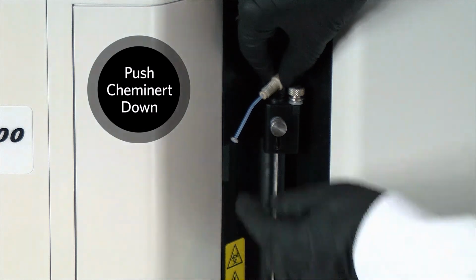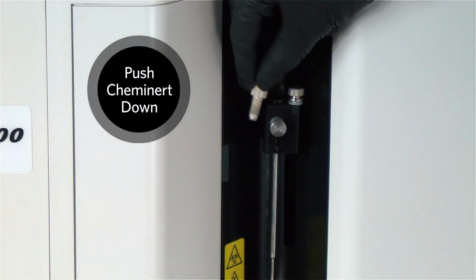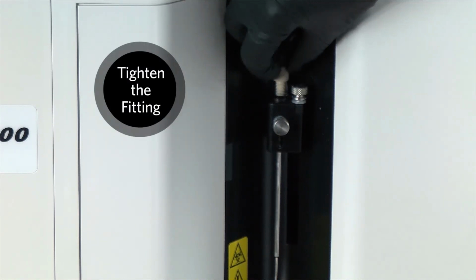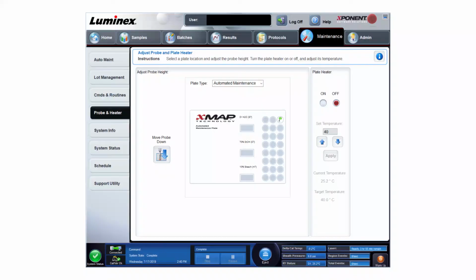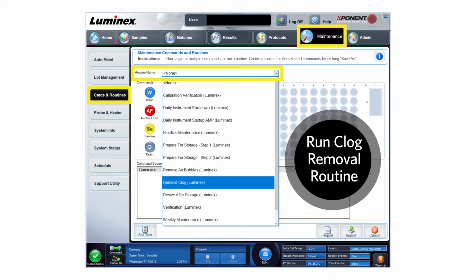After the sample probe bypass is performed, push the Cheminert fitting back down so it sits at the end of the sample line. Place the Cheminert fitting back and tighten the fitting. Perform a probe height adjustment. Finally, run the clog removal routine in the xPONENT software.